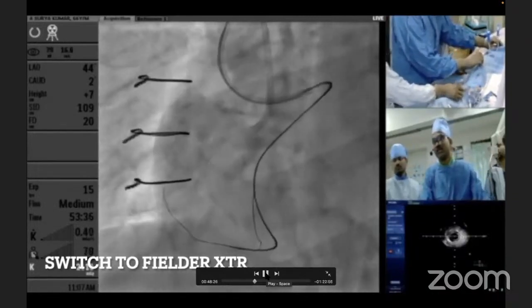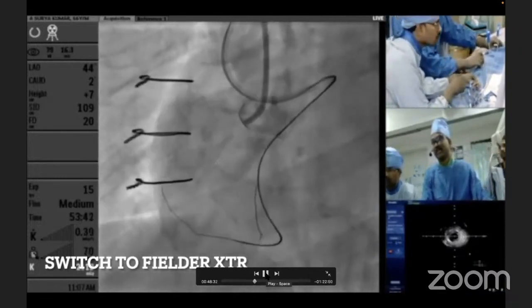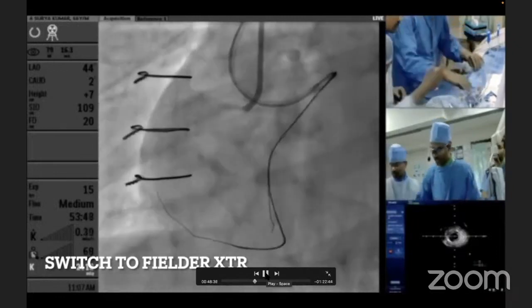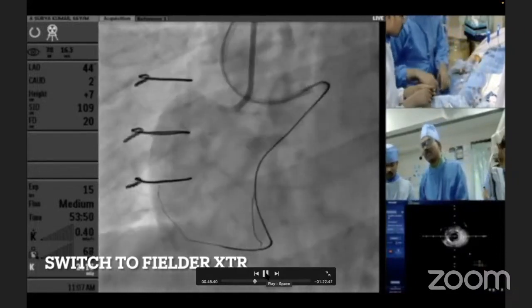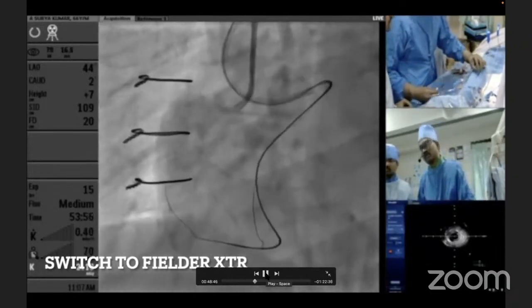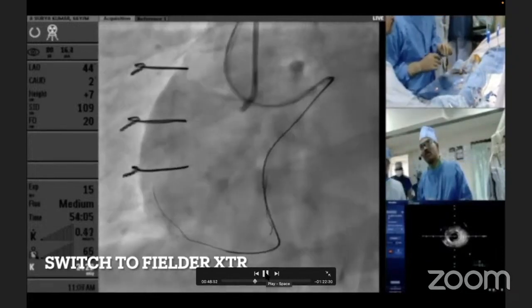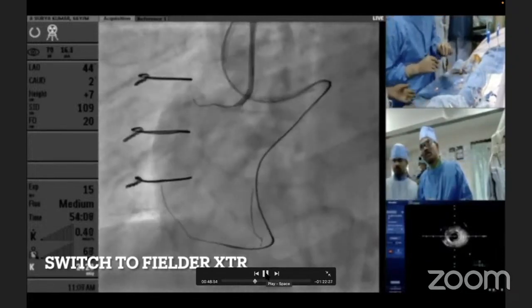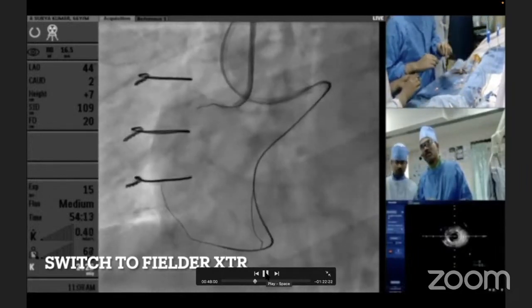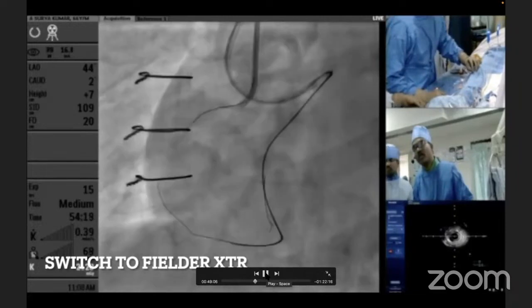Oh, first I always, in this case, Vijay, you should know where you are first. So if there is no venous graft here, probably I would have taken Gladius. And what I'll do with Gladius, first I try and advance Gladius. If it doesn't advance, then just knuckle the same wire and go up. Yeah, because that is the safest one, right? So knuckle one forms in the vessel architecture, it moves up. Yeah. But the important thing is here, first you have to differentiate whether you are in SVG or RCA.